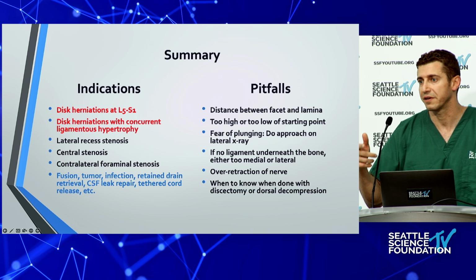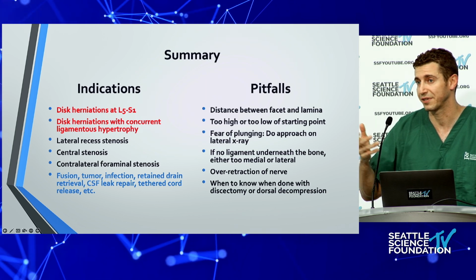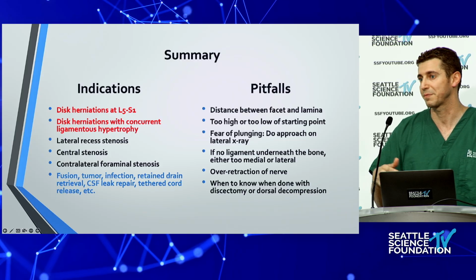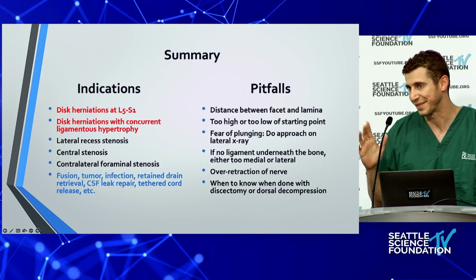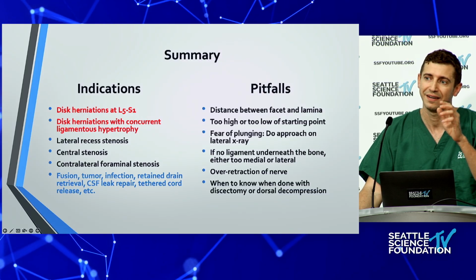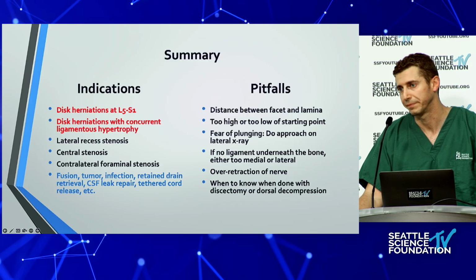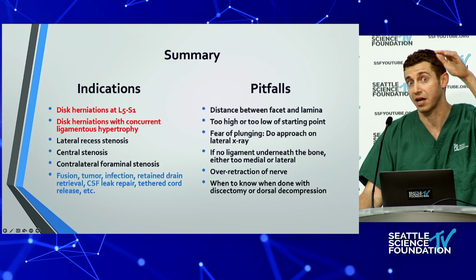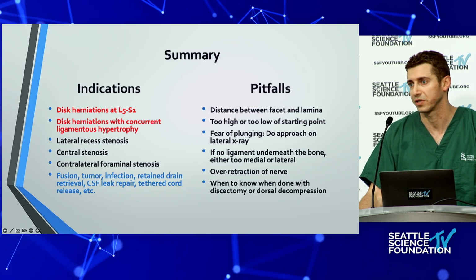And the reason why is, if you're thoughtful and careful, the visualization is perfect. A lot of times you say, oh, I didn't see that bite. But in endoscopy, you don't have that excuse. You're supposed to see every bite. If you don't see every bite, then you shouldn't take that bite. But if it's like spaghetti, you could put a second port to close it off, or open. I haven't gotten to that point, those last two things, but they are on my mind always.